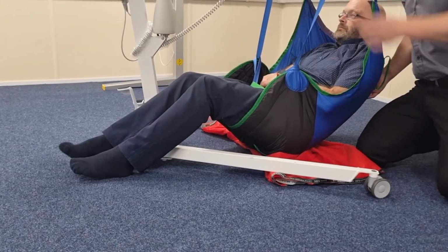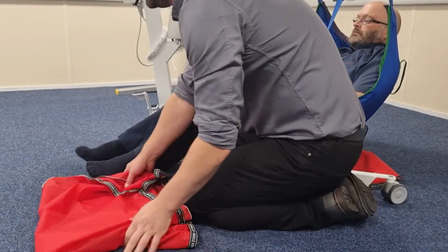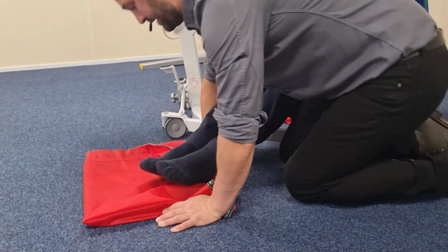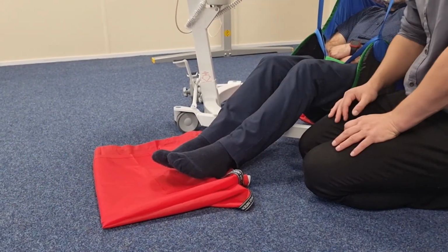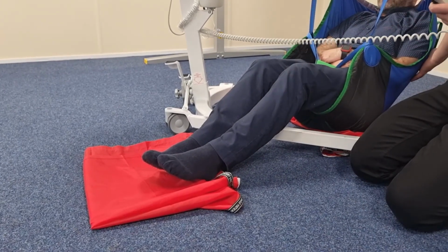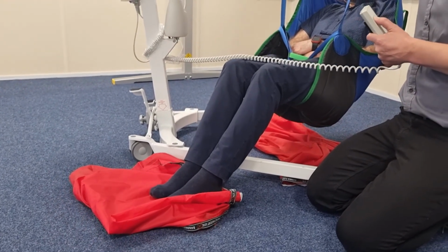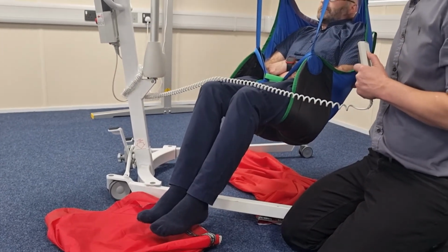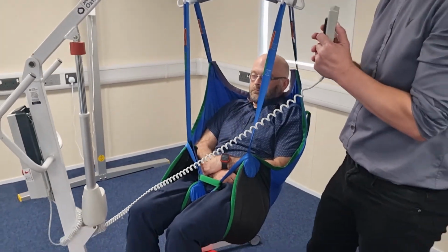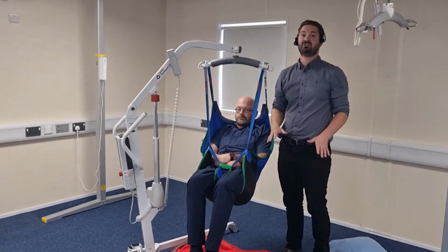And then as it starts to lift, I'm going to place another slide sheet just underneath the person's heels. And I'm just going to bring them away from the metalwork of the hoist. Okay, and then I can continue with the lift. And there we go. Once they're up high enough, I can then complete the transfer either into a chair or back onto bed.